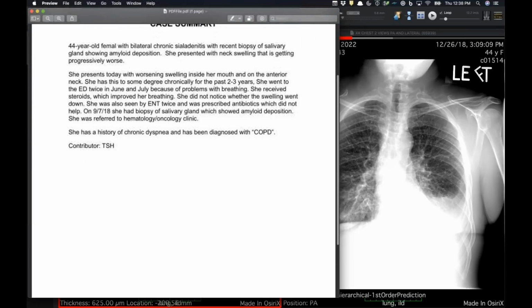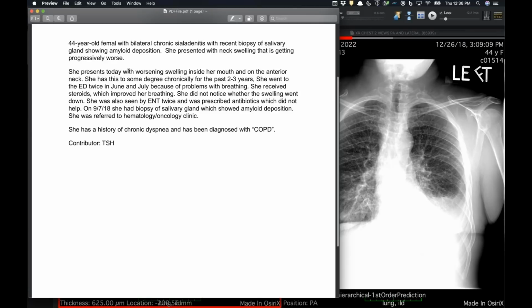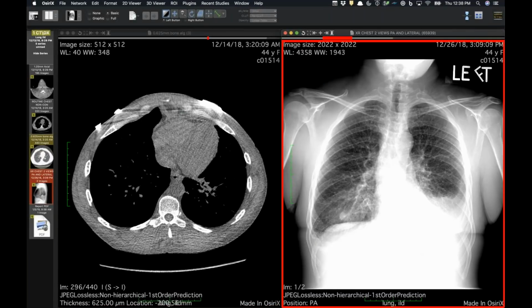I don't know what your experience has been, but how many of you who do the cardiac stuff, we used to see a lot of cardiac amyloid, and I have to say the ones with parenchymal involvement, I can't think of one, and vice versa. I'm sure there are cases, but it's interesting that the ones that have really bad parenchymal involvement, the hearts are usually normal, and the ones with really bad cardiac involvement, the lungs are usually normal.